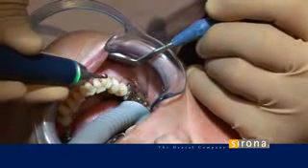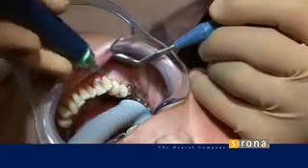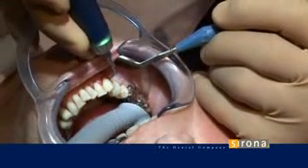Now we check again, and the unit continuously shows green.